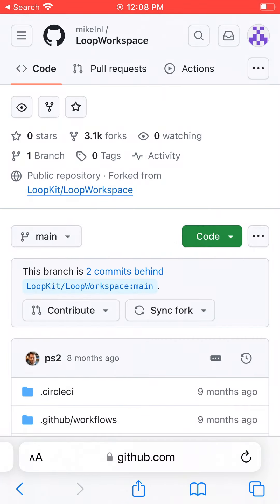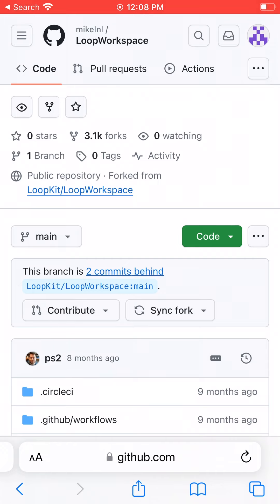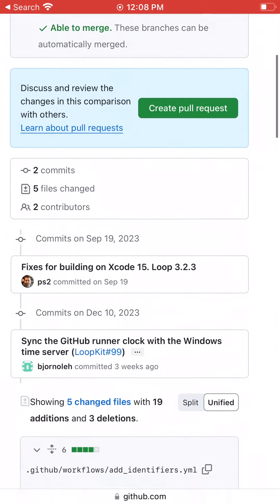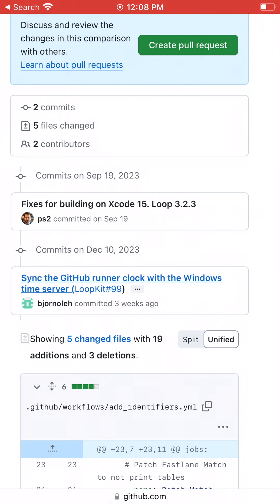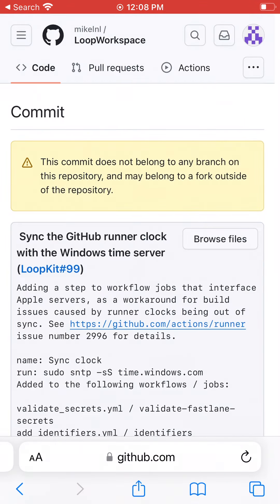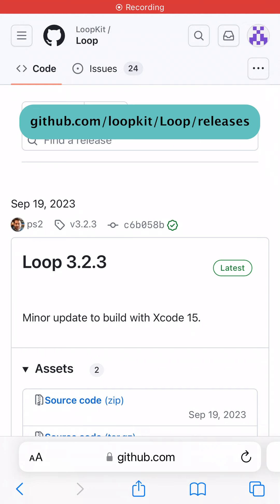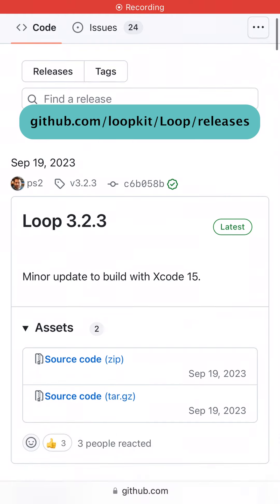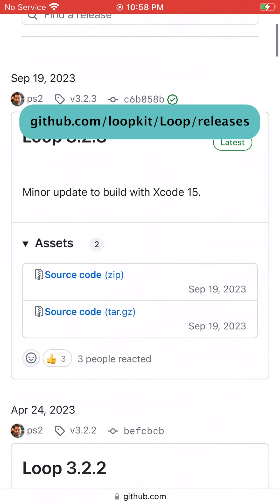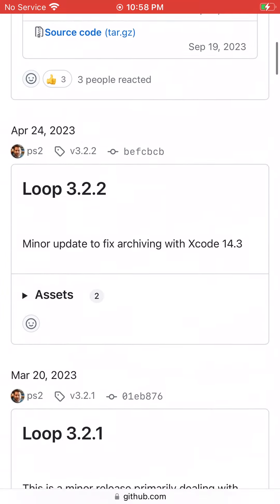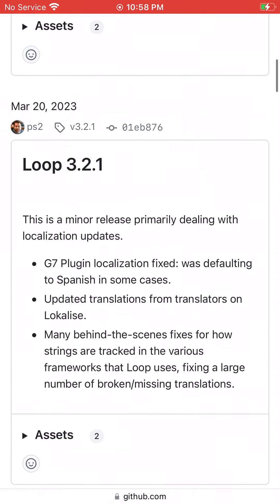To get a rough overview of what was changed since the last time you updated, you can tap 'X commits behind.' In this case, we're two commits behind. Tapping on each commit should give you a little more information, but there's a good chance it might be written too technically for many to understand. A more readable list of changes can be found by going to github.com forward slash LoopKit forward slash Loop forward slash releases and reading the description of every version since the last time you built.